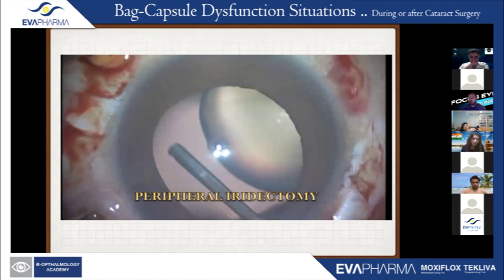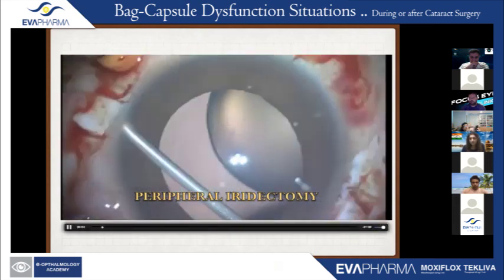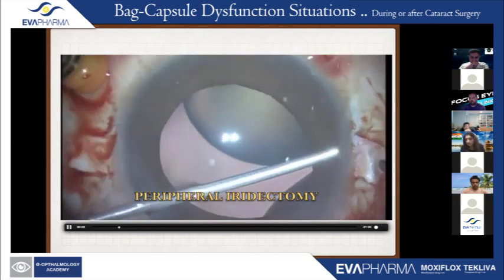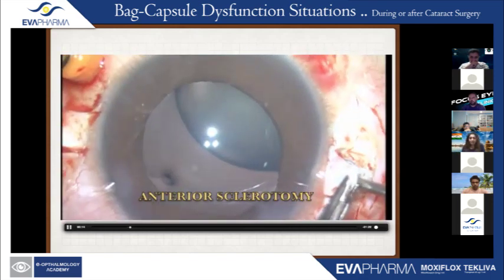probe itself. So from the point where you really want to introduce your sclerotomy, when you want to externalize your haptics, at that point you go ahead and make a peripheral iridectomy so that you do not have any strands in the anterior chamber, cut beneath the 180, so that you do not really have any dragging of the iris tissue going on. So this is what you just saw on either side: that peripheral iridectomy is being done beneath the scleral flaps at the proposed site.